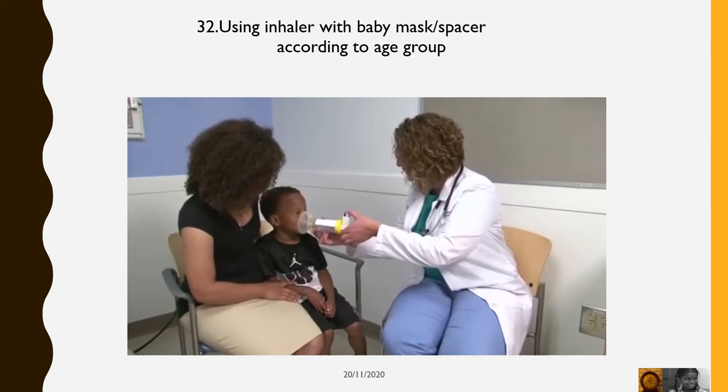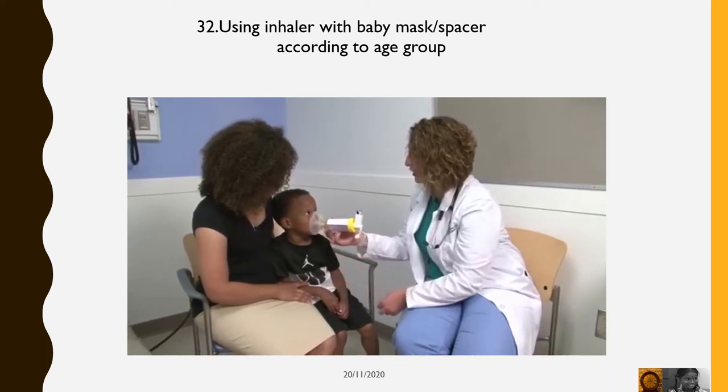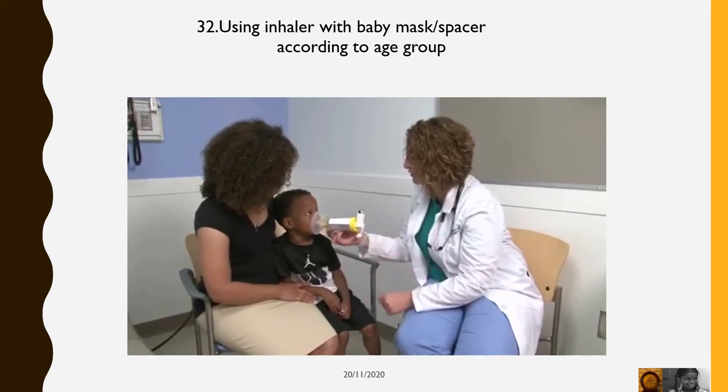Many times, the correct dose of your medicine will be to inhale two puffs. If this is what is prescribed for you, then wait one minute after the first puff and then follow all of the steps again.